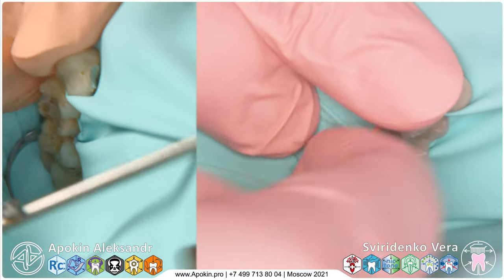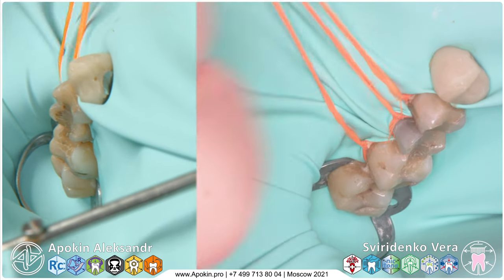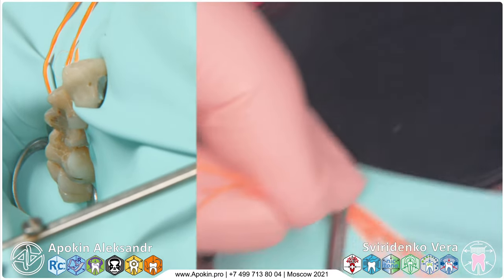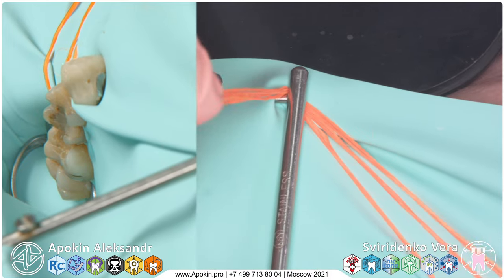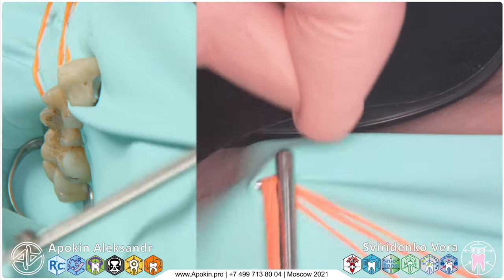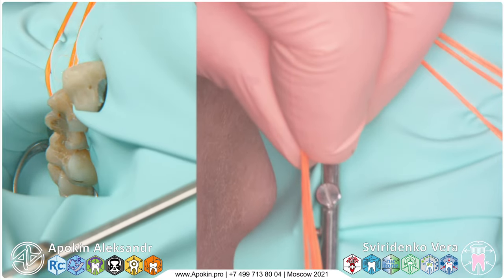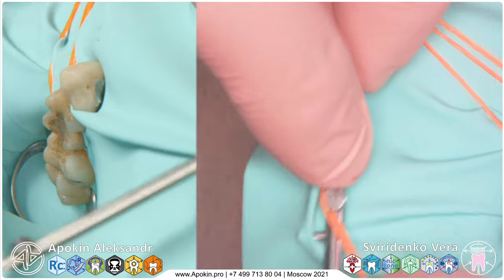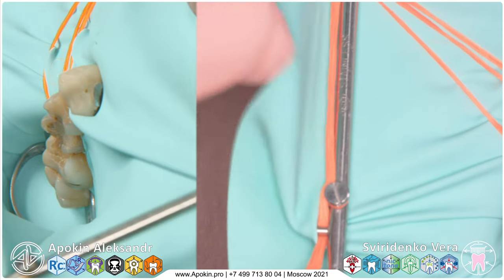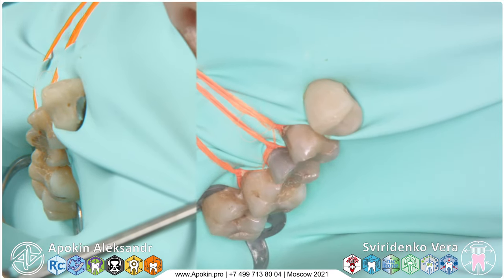Why do we need so many ligatures? Because these are the indicators that we are very near to our rubber dam interdental part. We made the tension in this area and then around this screw and then under this rubber dam. That's all. We're starting with preparation of hard tissues.